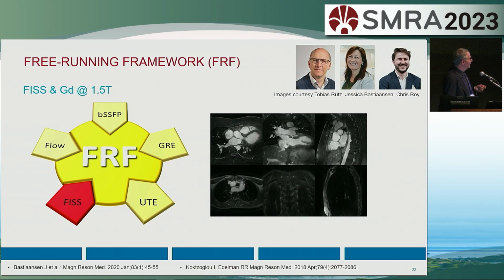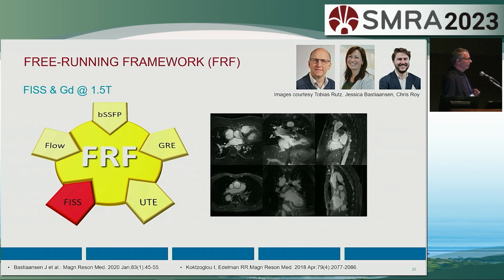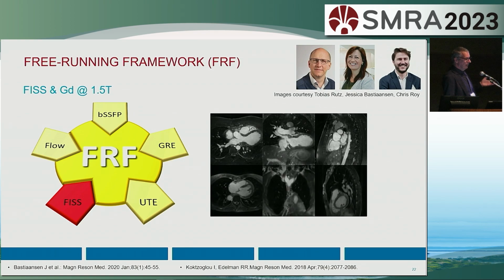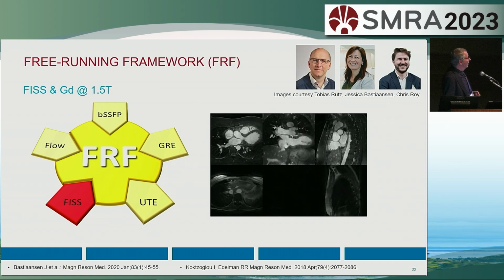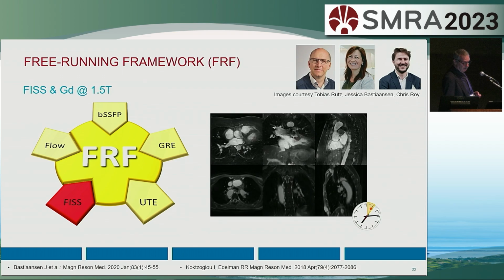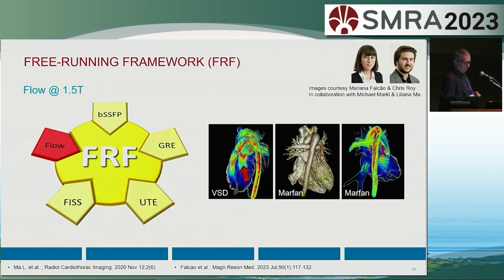We implemented it, and now our cardiologists relatively routinely every week now acquire a couple of patients with this technique post-contrast, because in most patients, contrast agent is on board anyway, and this scan duration is about 5 minutes. And here is one of these publications we did together again with Bob Edelman and John Kokzoglu.